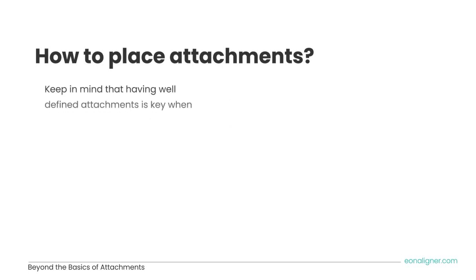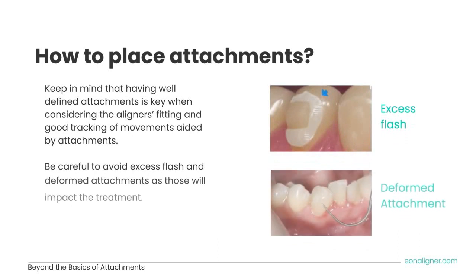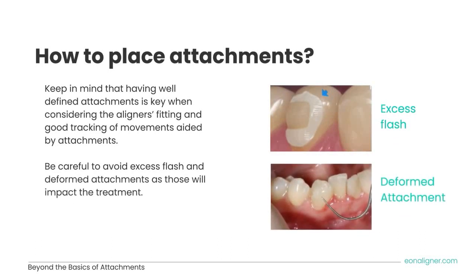Keep in mind that having well-defined attachments is key when considering the aligner's fitting and good tracking of movements aided by attachments. Always check and make sure to avoid excess flash and deformed attachments, as those will impact the treatment.